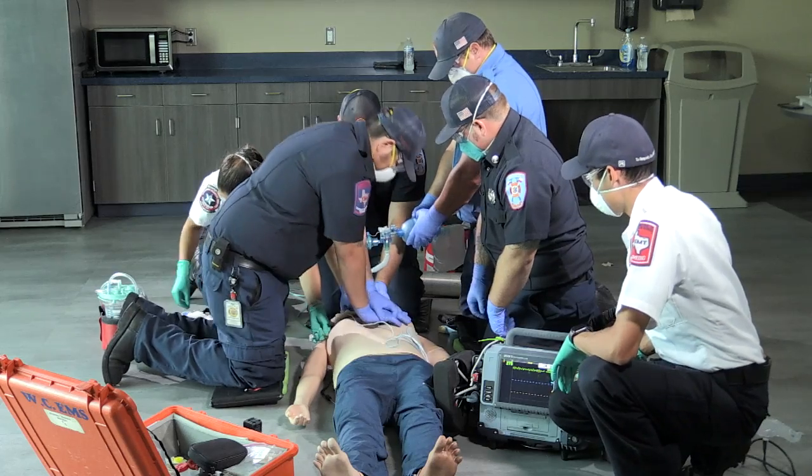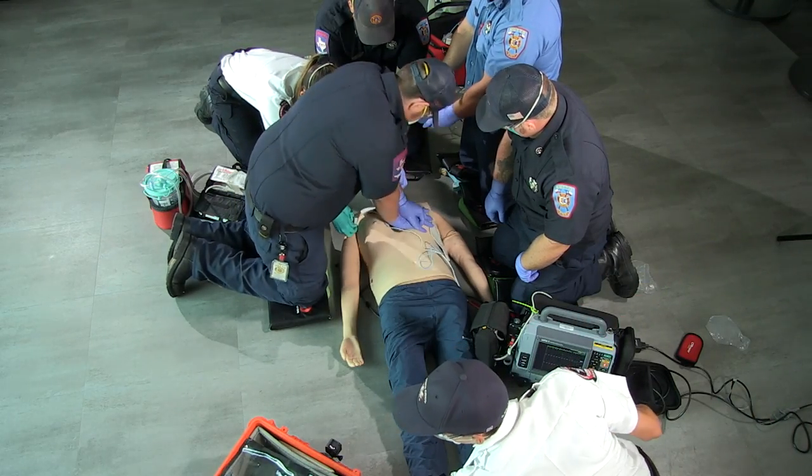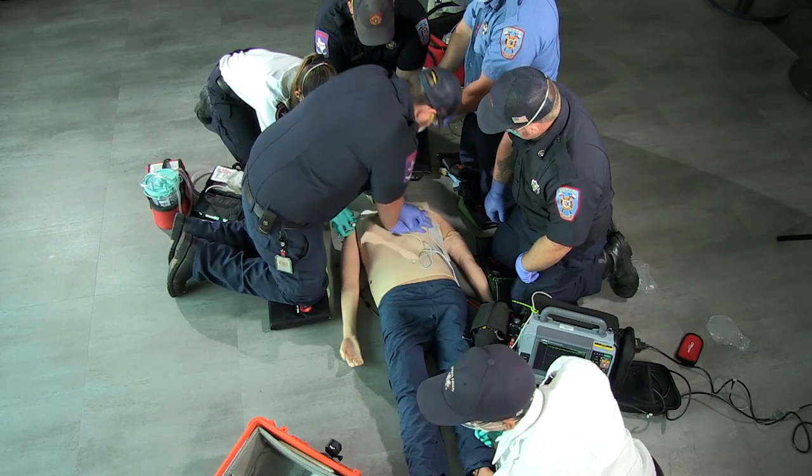Let me know when you get to 75. Yes, sir. IO is in. Abbie, you're going to push 1mg Epi, 1-10,000.